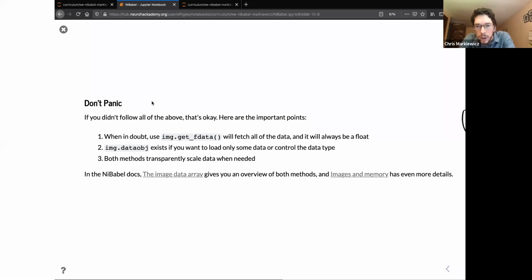Just to clarify, does working with array proxies speed up the processing? Often it does. The most common way that you'll want to use them is the slicing. If you only need to get a subset of your data, the slicing will save you both time and memory, so that you're not wasting time loading and representing data that you have no intention of working with.